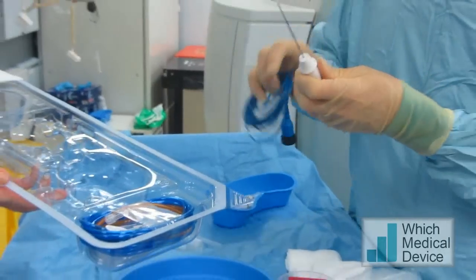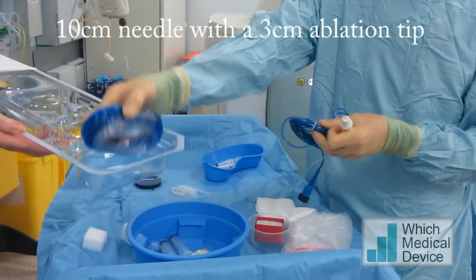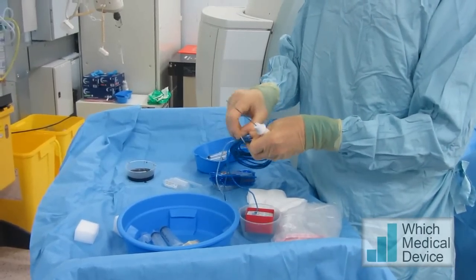This is a cool tip ablation needle — a short 10cm needle which should be long enough to get to the relatively superficial lesion that we're aiming for. It has a 3cm ablation tip.